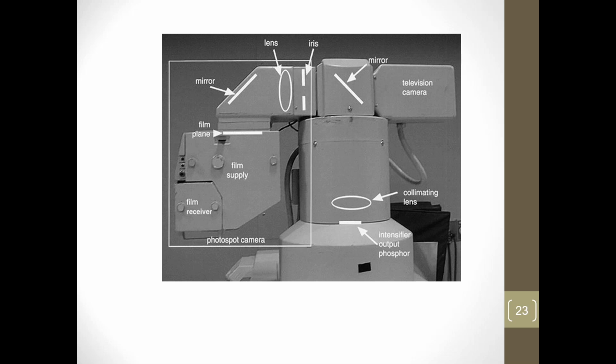So it was kind of a cumbersome process, but that was really the only way that the cardiologist could look back and see where he was and what he was doing. Now systems have road mapping, and it's all instantaneous and digitally available, so they could just press a button and see everything that they've done the whole case without having to stop.